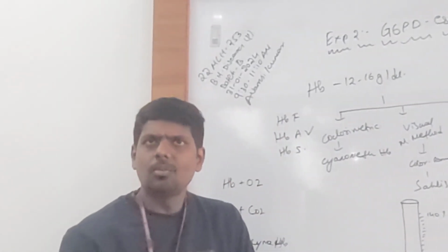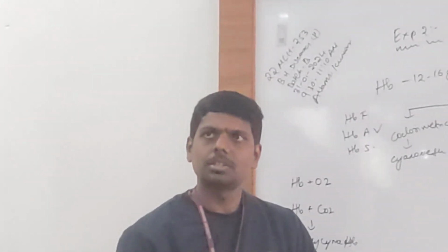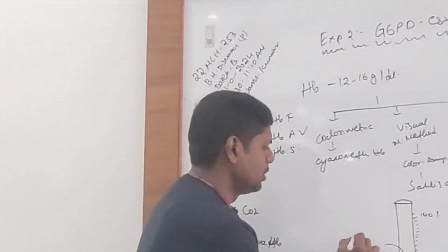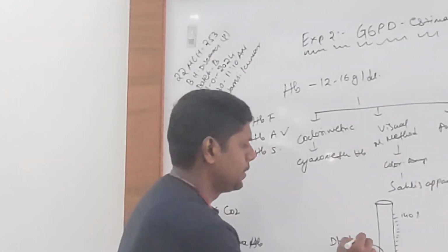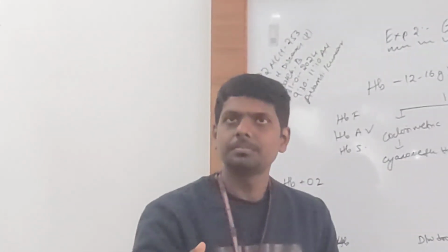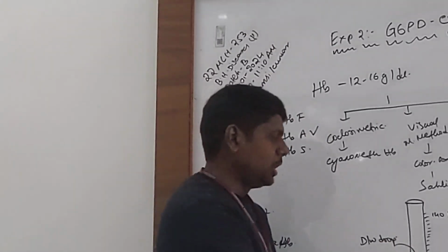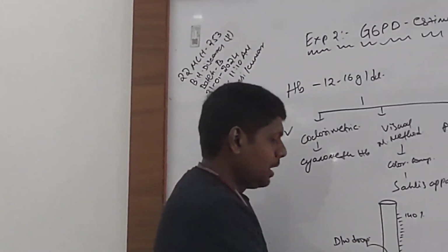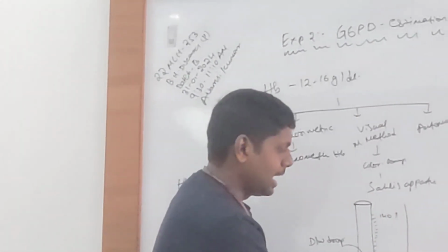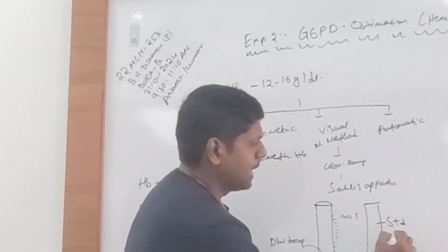After 10 minutes, now you have a brown color solution. Now to it, you will start adding distilled water drop by drop. You are dissolving it to make it lighter. Now the solution will become pale. The solution should become pale to an extent where the color matches the comparator color. There is a standard comparator color.